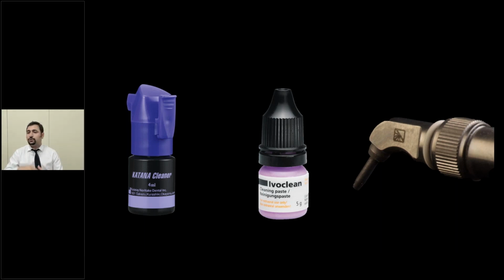I don't know how long the crown was in the lab. It's not nobody's fault, it just takes time. So I really prefer using air abrasion. But if you have IvoClean, how do we use that?